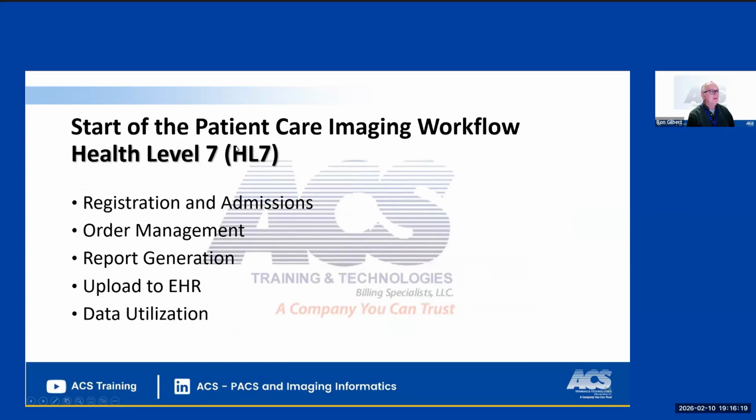Another standard we use is HL7. That's the start of the patient care imaging workflow. All of the hospital IT systems run in HL7. It isn't exclusive to radiology, but it has admissions, order management, report generation, and then uploads to the EHR, and also sends the links so you can see the images in the chart, and also statistics on how you utilize that data in other systems and pass it around. So there are the two big standards you need to understand in PACS administration, and we will go over it to get you going on your way.